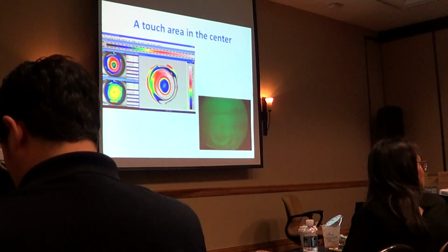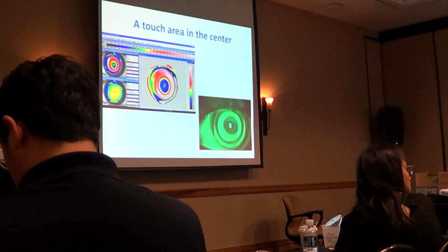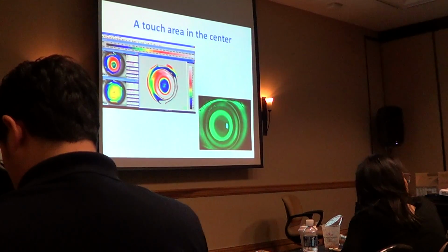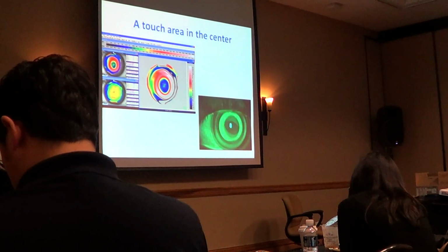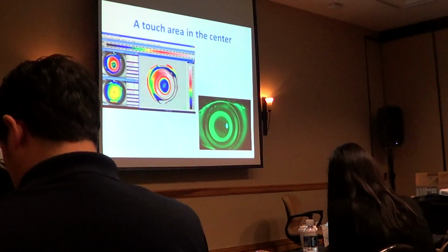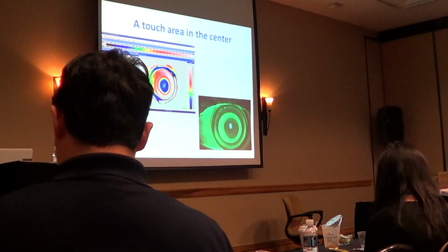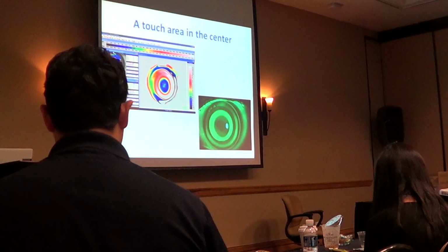Okay, there's another question. What you're trying to say is the central island is caused by an area of inflammation as the lens is rubbing against it. Now, does this occur right away? Do you see this happen through time? So how long does it take for this kind of pattern to form, is my question? Something like four days, over a week, you can see this. Okay, I didn't know whether the fit could be fine for half a year, and then all of a sudden you could form something like this. See what I'm saying? Yeah, okay, I think I got your question.